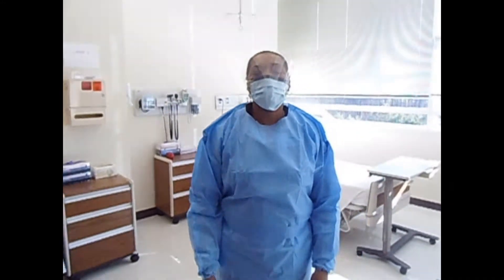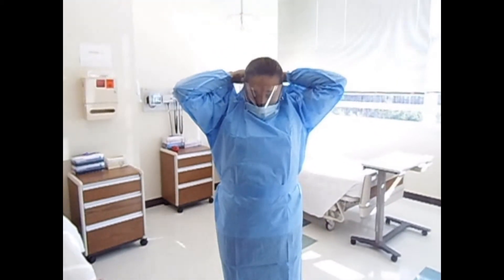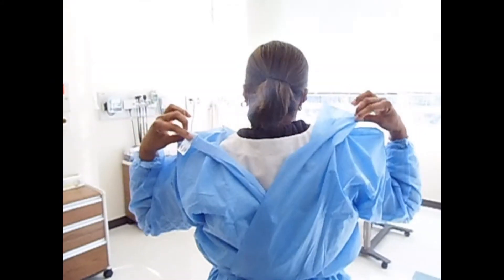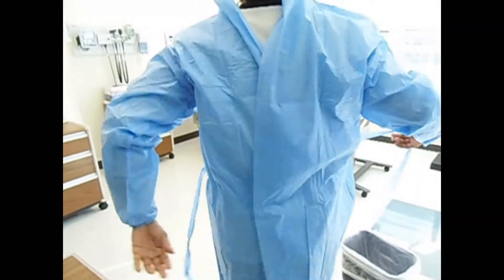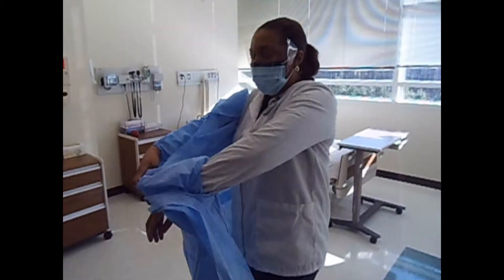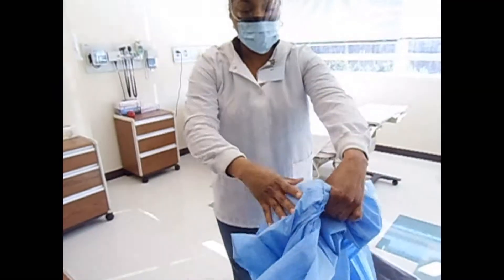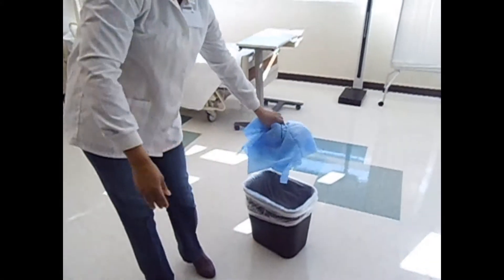The next personal protective equipment to remove is the gown. Unfasten the top portion — in this case, remove the velcro from the neck. Then untie the gown. Go back to the top of the neck, go inside the gown, and pull it over your sleeves and down your arms. Roll the gown inside-out with the clean part facing out, and discard in the container.